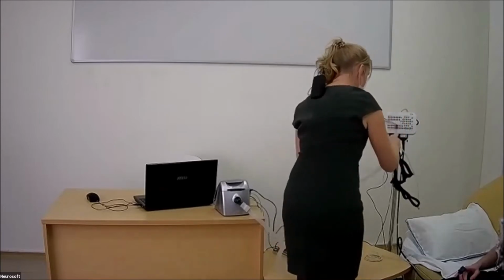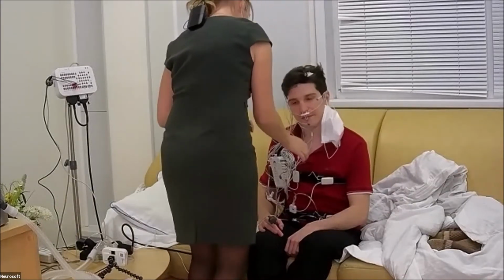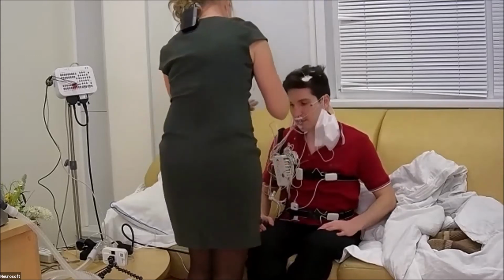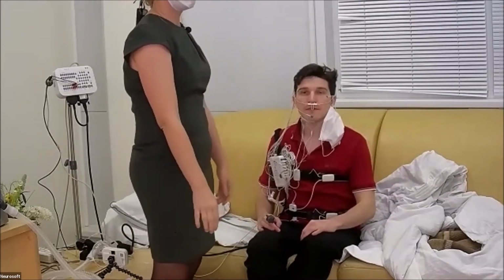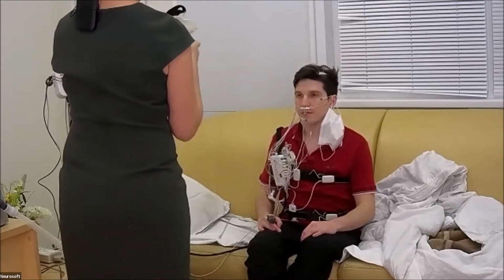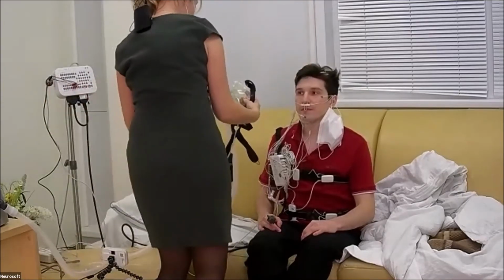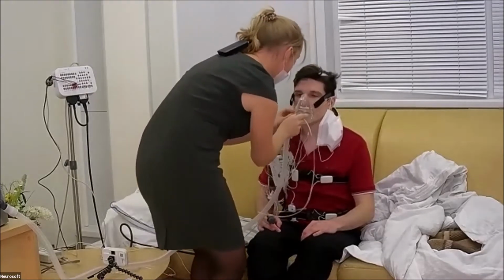Now I take out the cannula. And look here, the thermistor sensor is on the patient now. I think it's not very comfortable, but we try to show you that we can do it. And now we put this mask on the patient. Is that okay? Yes, all right.